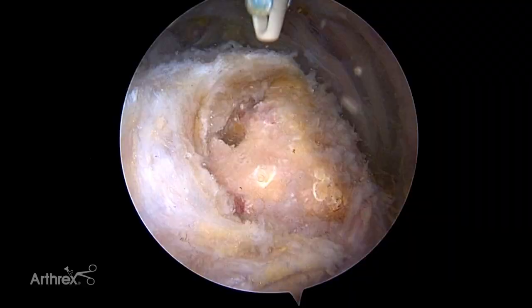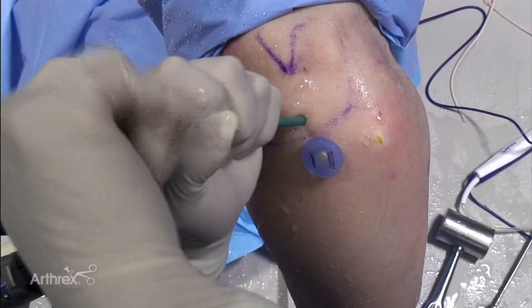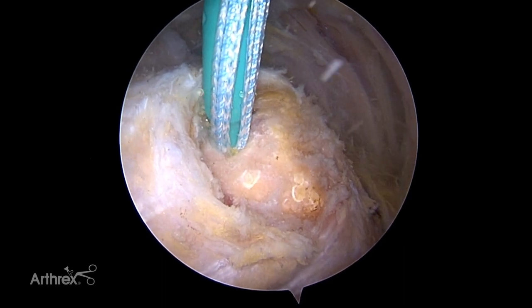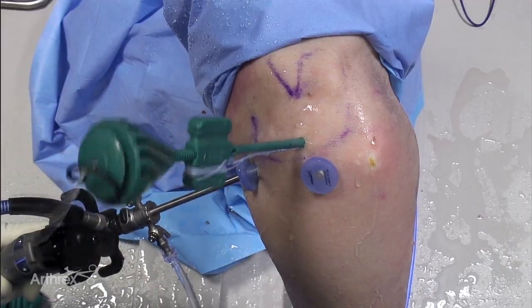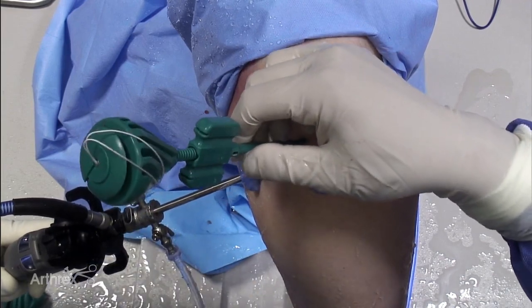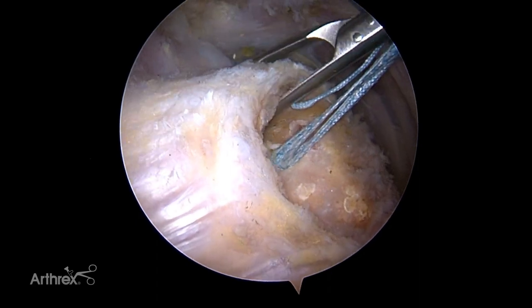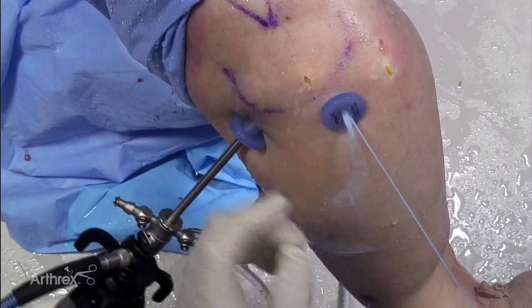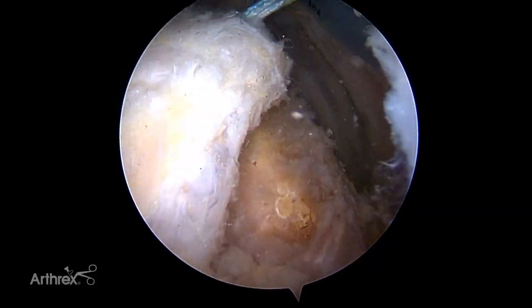A vented swivel lock with a pre-loaded fiber tape loop is inserted into the socket. The pre-loaded fiber tape loop is released from the thumb pad and the number 2 fiber wire tip retention suture is discarded. The fiber tape is retrieved laterally. The fiber tape limbs are joined into a single tail to allow easy passage with a fast pass scorpion, which automatically retrieves the passed suture.